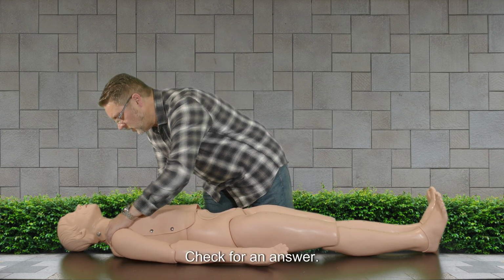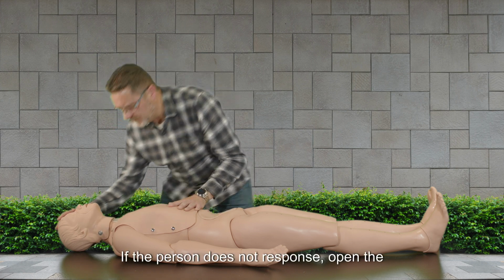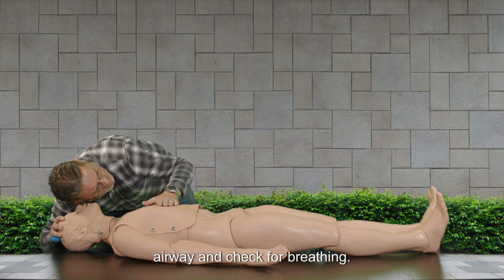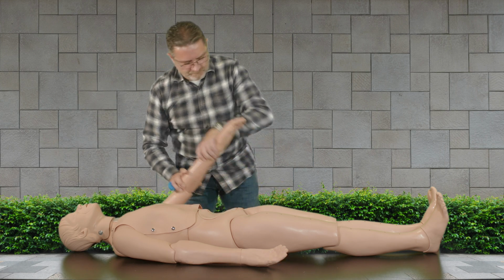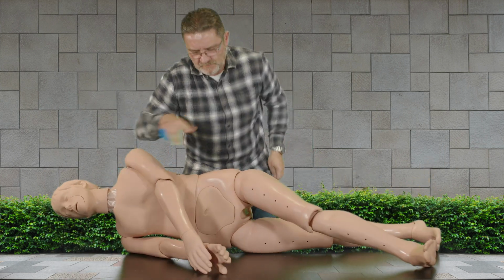Check for an answer. Shake gently, asking, "Are you okay?" If the person does not respond, open the airway and check for breathing. If they are breathing normally, place them in the recovery position. Call 112.